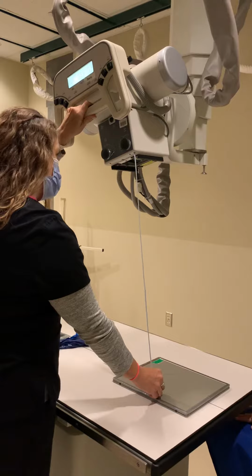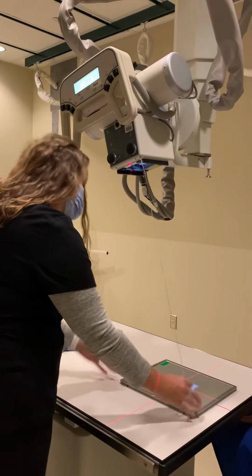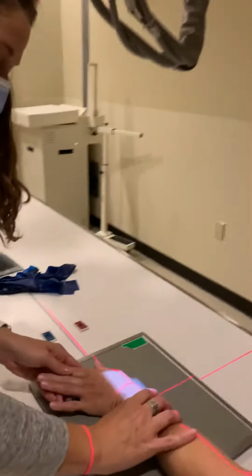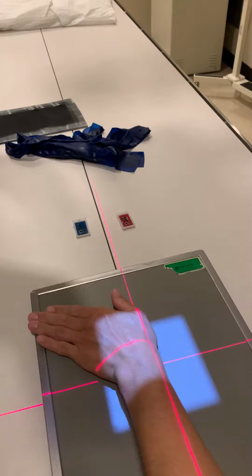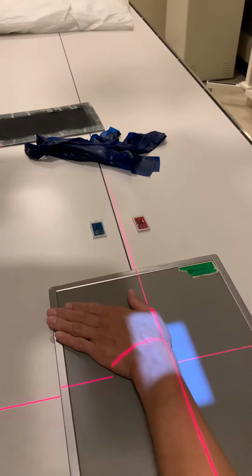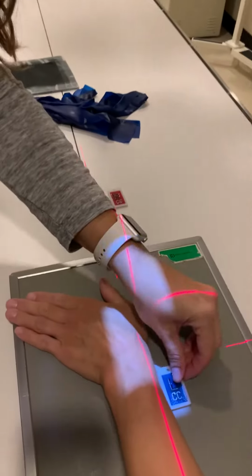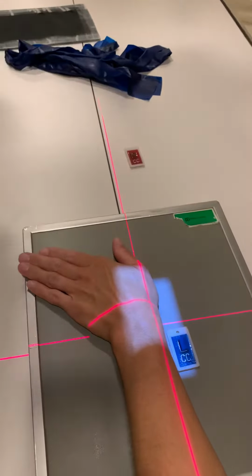We're going to have you have a 10 to 15 degree angle toward the elbow. For lab practice, we will only do 15 degrees. You center on the scaphoid navicular bone. Then we're going to collimate 2.5 inches proximal and distal to the wrist joint and 1 inch on both sides of the scaphoid. We have the correct lead marker.